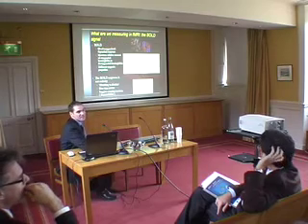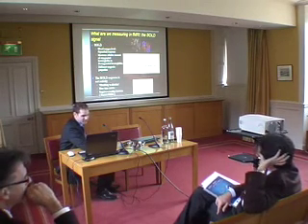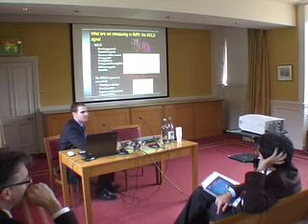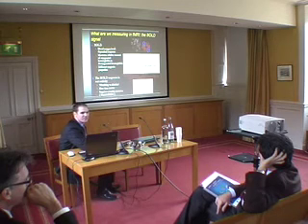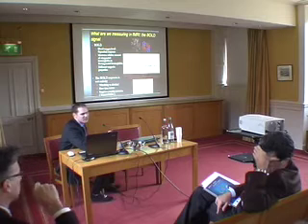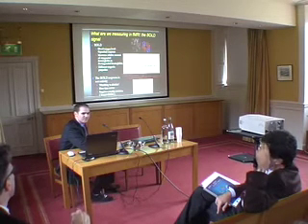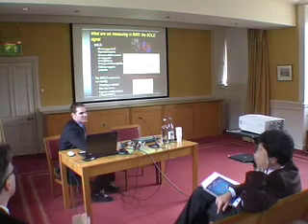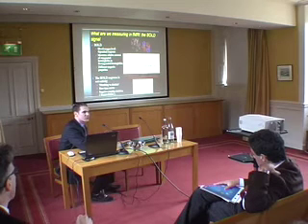So what we're really looking at is something called the BOLD response. That's the blood oxygen level dependent response. And the BOLD response relies on some very simple physiology, which I hope you might remember from school, and that is that your red blood cells, you can see a picture of them in the top at the middle, carry this marvellous molecule hemoglobin, which attaches to oxygen and carries it around your body for you. And this particular molecule, this protein, has a different magnetic property depending on whether it happens to be bound to oxygen or whether it happens not to be bound to oxygen. And that's what MRI takes advantage of.